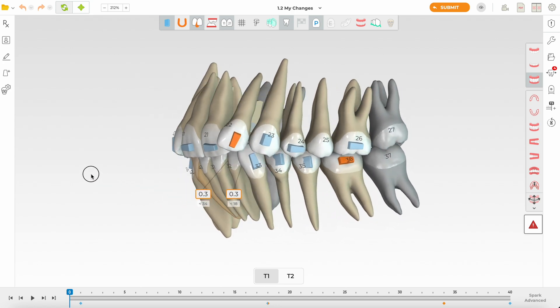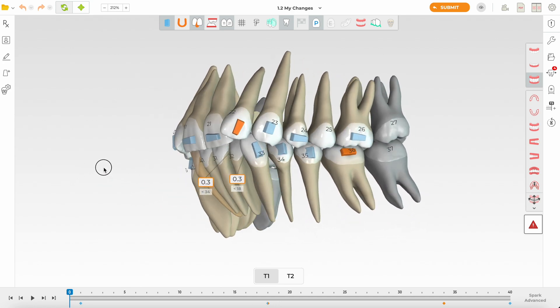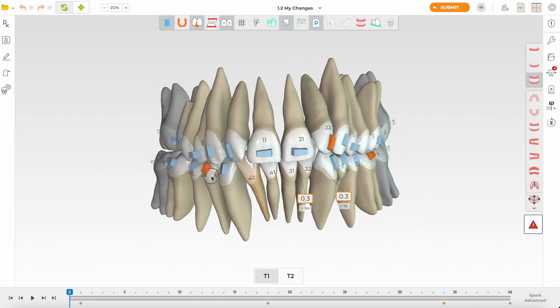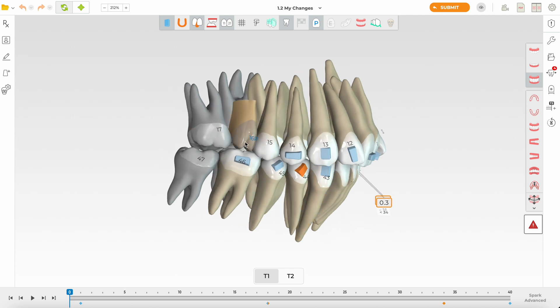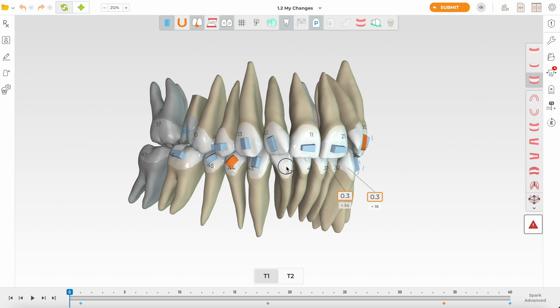Looking at this case, we're seeing an adult with a deep bite and moderately retroclined upper and lower incisors. The upper first molar (1.6) is lost, and I suggest that the 1.7 be distalized to create more space for a future implant, which is the planned treatment.